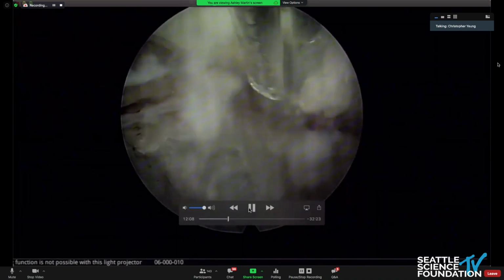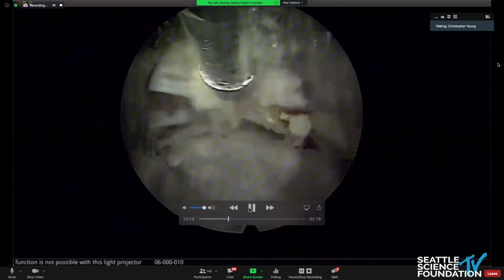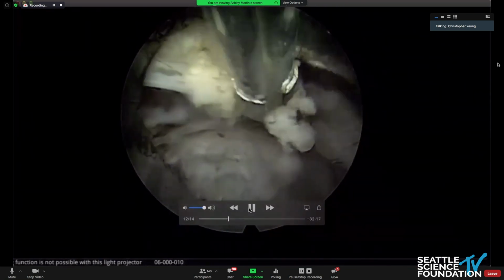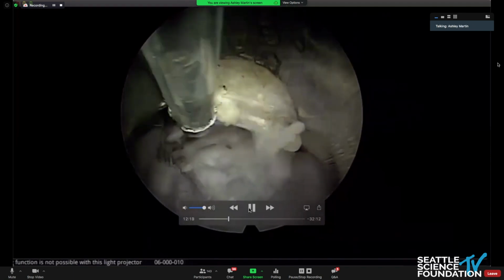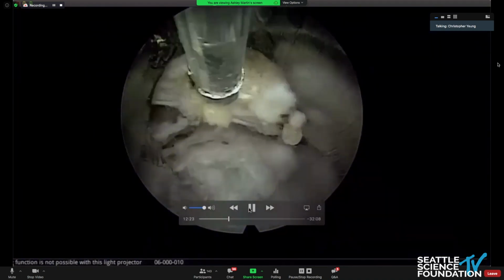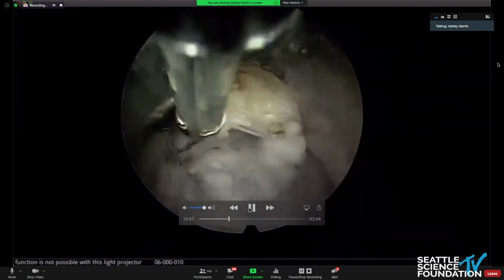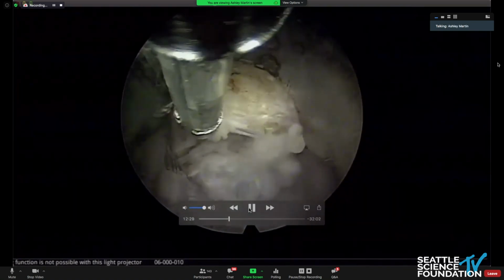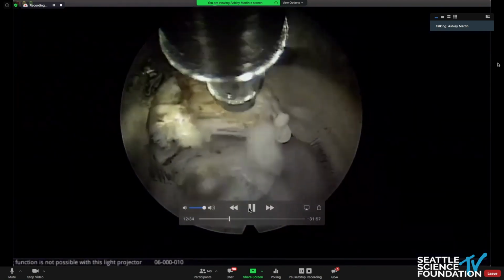And this is one of the most important instruments of endoscopic surgery, the Eloquence bipolar probe. So this probe is very specific. Hemostasis. Energy. And it also dissects soft tissue out of the way. Up here on top, that's the undersurface of the superior articular facet. You can feel a little bit of bony resistance. I'm just kind of cauterizing some of the soft tissue off of there to expose that.